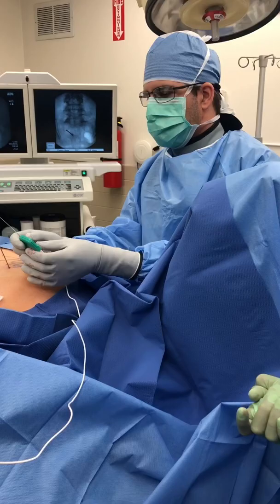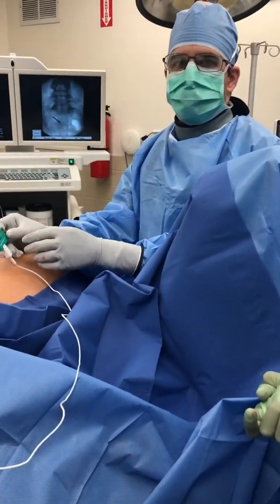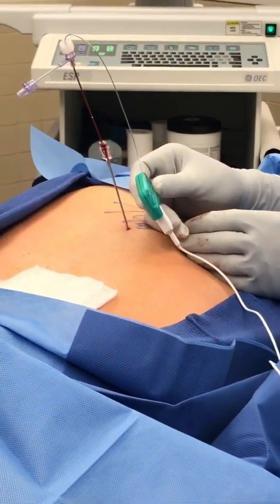We just concluded testing. On the left side we were able to place the DRG lead, and this is the connection device so we can undergo the actual testing.